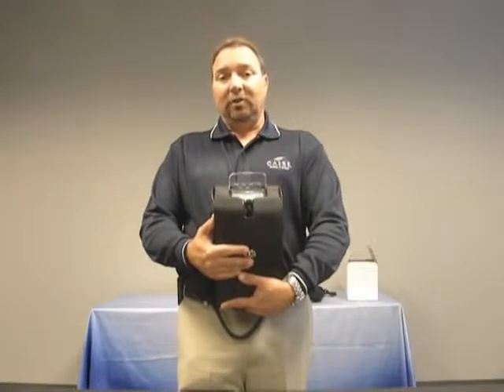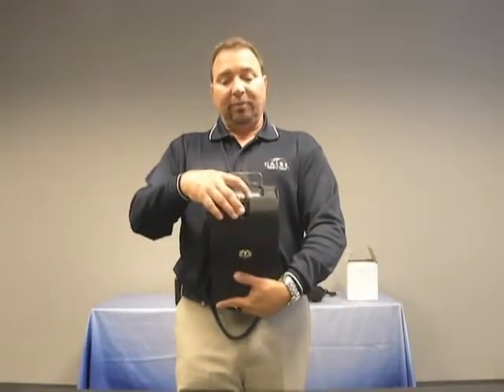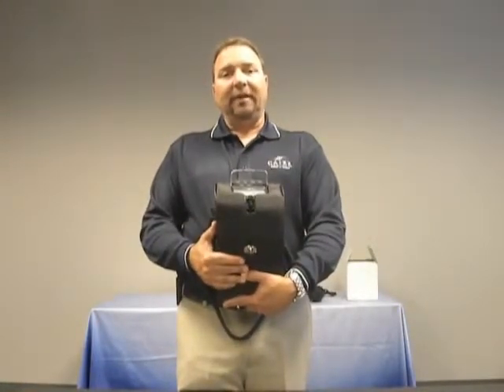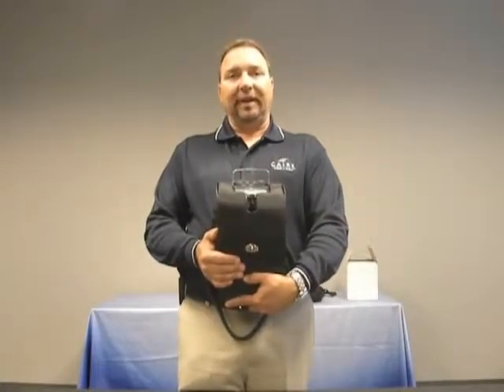Once you have completed your oxygen concentrator test, you can simply press button number 5 once again. This turns the device off, and at this point, the FreeStyle 5 is ready for patient use and application.